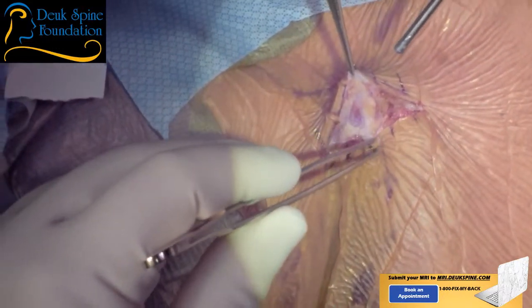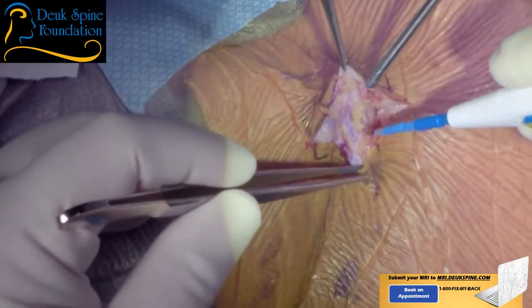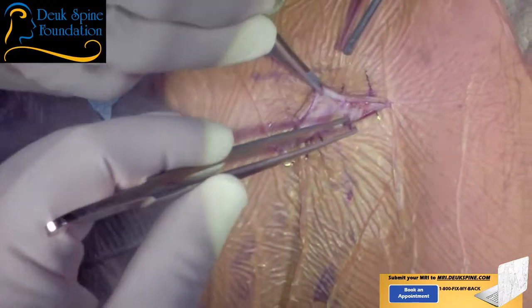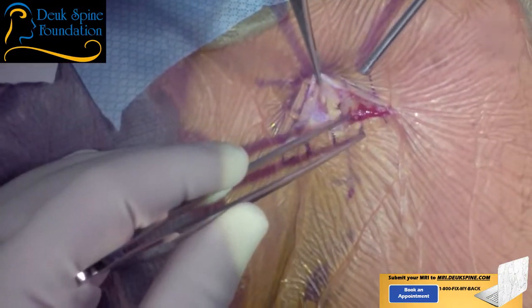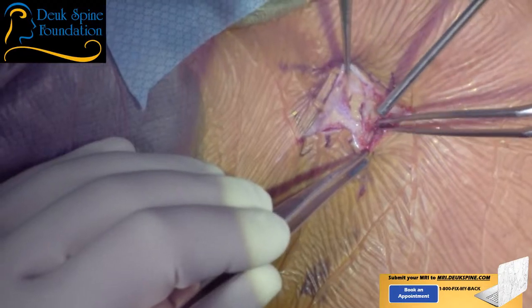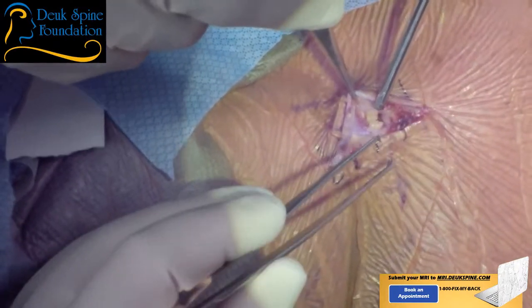Yes, sir. And we're going to go through the platysma muscle. Let me see the bipolar. We have a little bit of bleeding here from a little vein, or a little artery, just under the skin. We want to make sure we get that under control early on. Bovie.